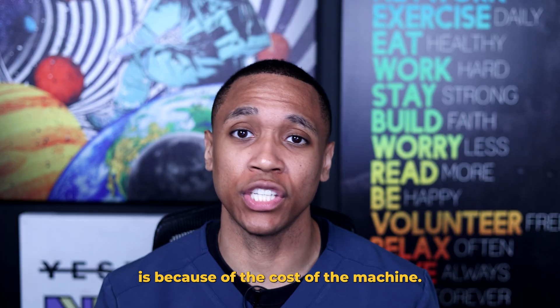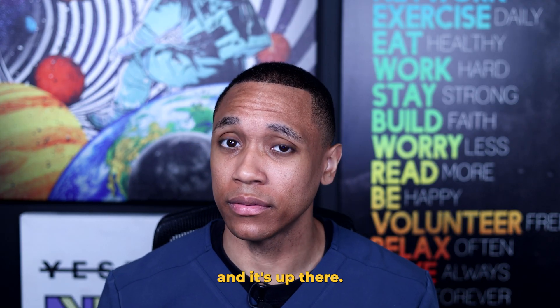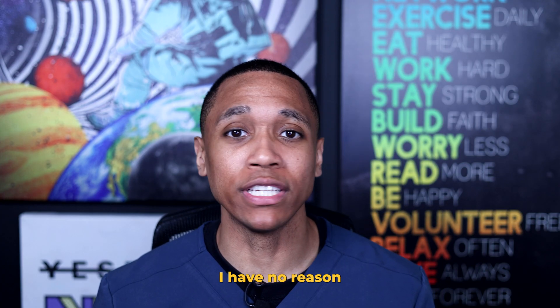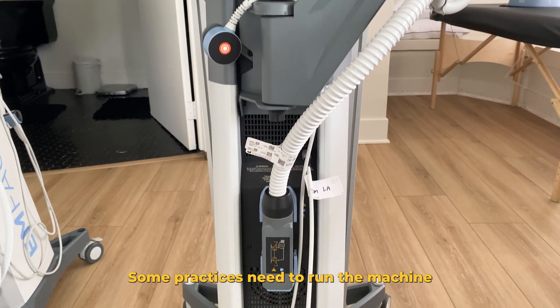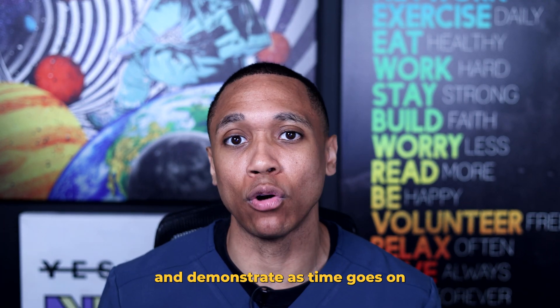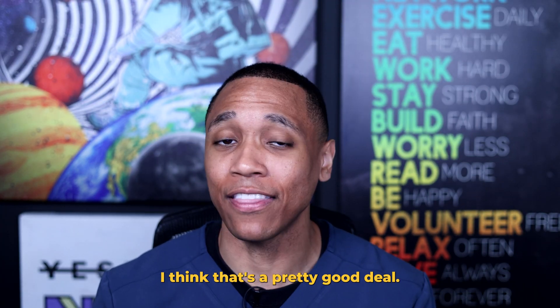The reason why that's important is because of the cost of the machine. Out of all the things to consider, the price tag is probably the biggest, and it's up there. I will not say the cost that I was quoted because my quote might be different from yours, but it's safe to say the quote is well into the six figures. Next is durability. I think this coil can do TMS, but how much TMS is the question. Some practices need to run the machine all day, five days a week at 120% MT. Can this coil and cooling system handle that kind of workload without overheating? That's a question that ExoMind will need to answer and demonstrate as time goes on. If it doesn't require that much juice to run and it can run all day, I think that's a pretty good deal.